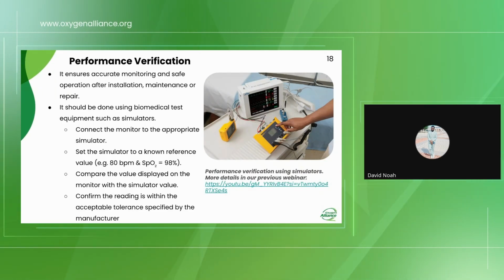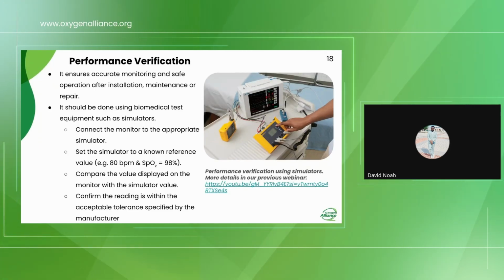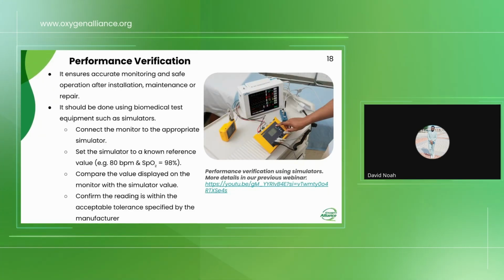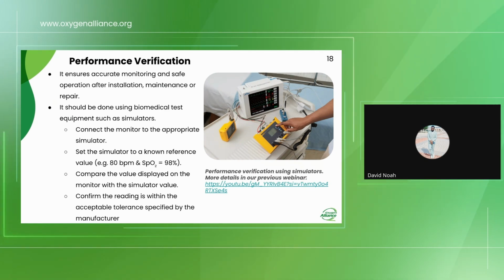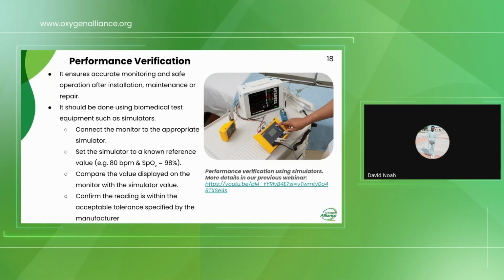This should be done using biomedical test equipment such as simulators. It should be noted that there are some specific simulators for specific modules, for example the SpO2 simulators and the NIBP simulators, and there are also some multi-parameter simulators which you can use for all the parameters.